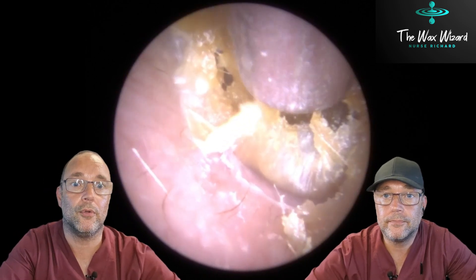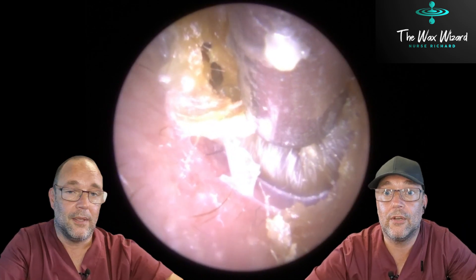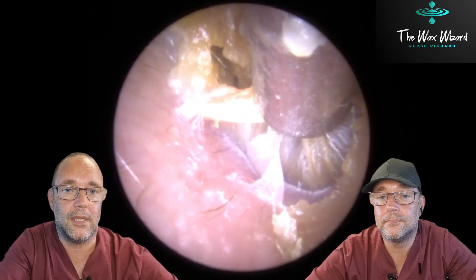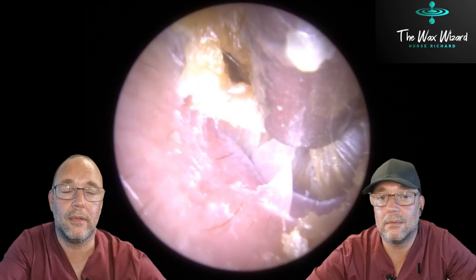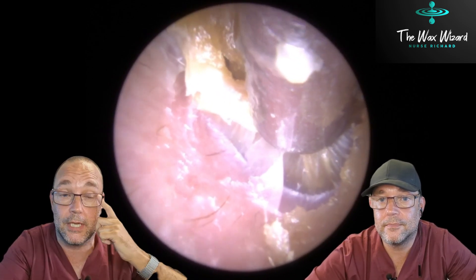Absolute donuts. That's right. Absolute donuts. Who doesn't know these days not to put a cotton bud in their ear? They're absolutely off the head, aren't they? Completely crackers. This chap tried a few things as well, hasn't he? He's not just tried cotton buds. What else has he tried? I think he put some hair grips in — a bobby pin — stuck a bobby pin in his ear trying to get it out that way. Anyway, made a right mess of this. Pushed it right down just in front of his eardrum.